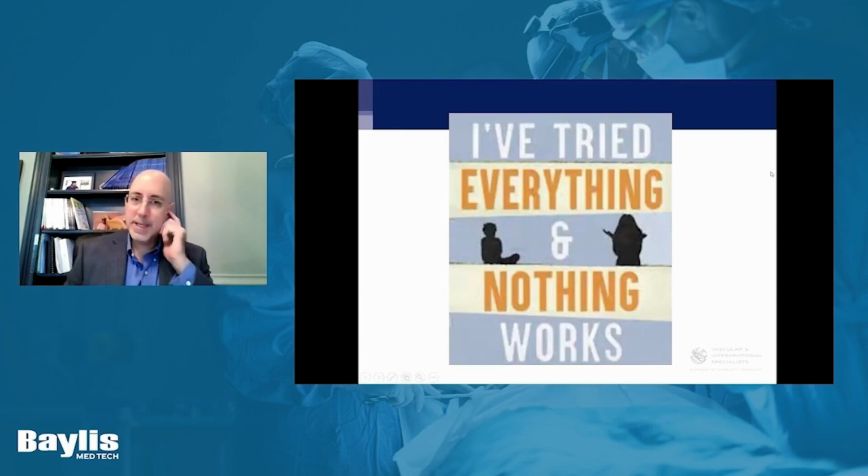So let's move on to the next stage, all right? For you all tuning in, it's clearly because you have an interest in the most complex occlusions. So you've tried everything, you've gone antegrade, retrograde, 035, 018, nothing's working.